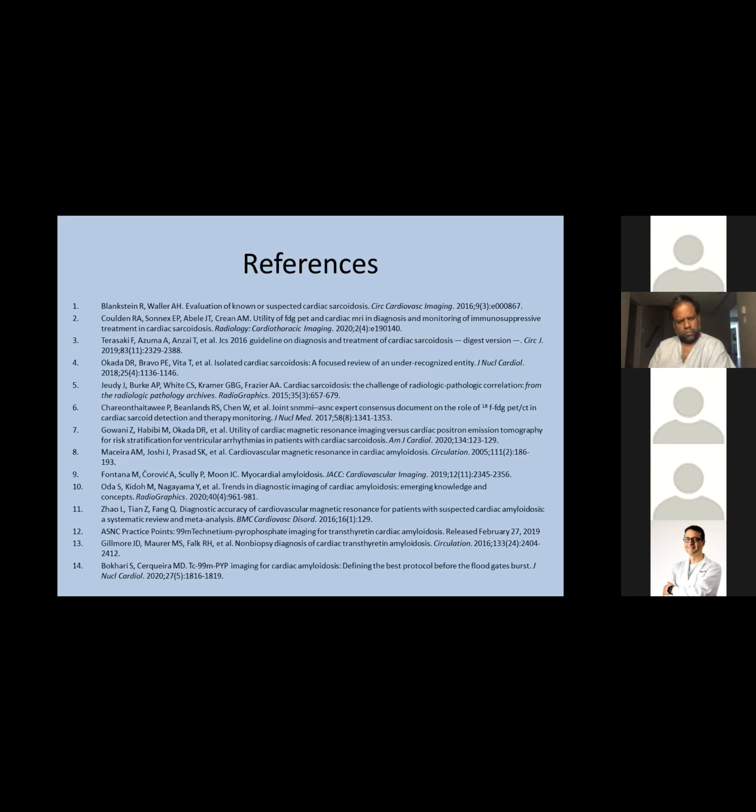Yeah, well, we've increased the number of scans we can do by cutting the time of imaging down to some degree with using more updated sequences. So right now our general capacity is routinely 3 patients per week. We sometimes will do 4 or 5 depending on demand if there are urgent inpatients.